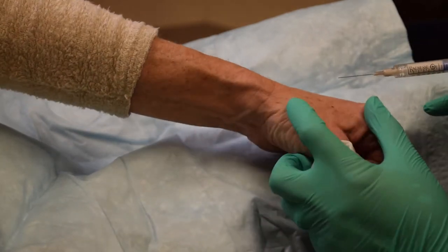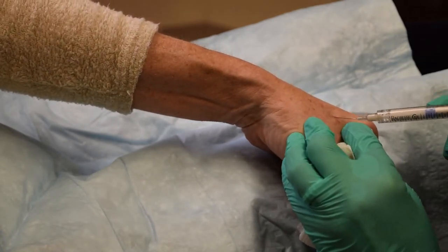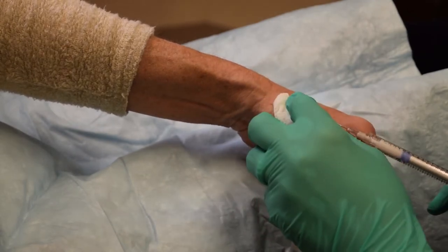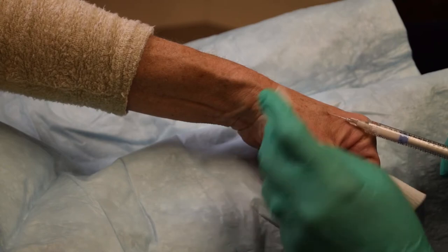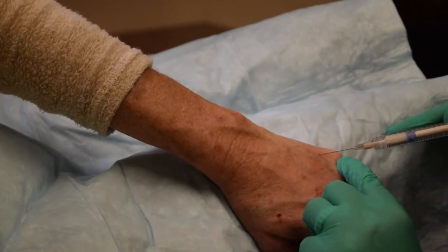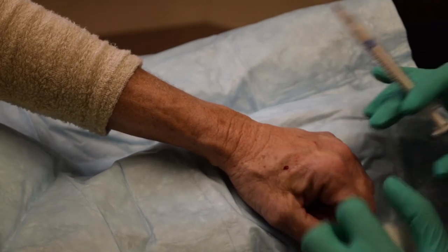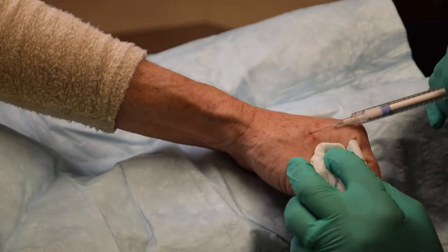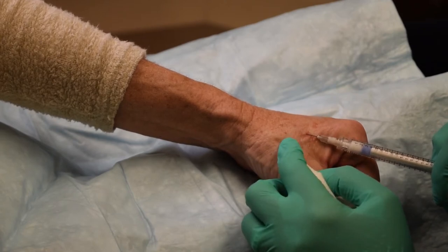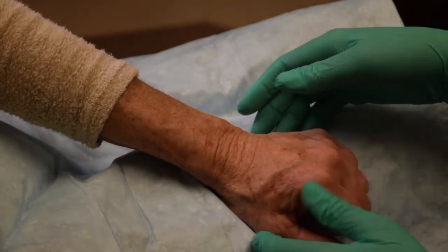Very few injection points. I'm going to place a larger bolus here because there is a larger area to correct. I'll fan it a little bit. Hardly anything in terms of bleeding, no bruising whatsoever. The gel moves quickly. There is usually some degree of asymmetry between hands; I will use what's left of my syringe on the left hand to correct a few minor areas on the right hand.